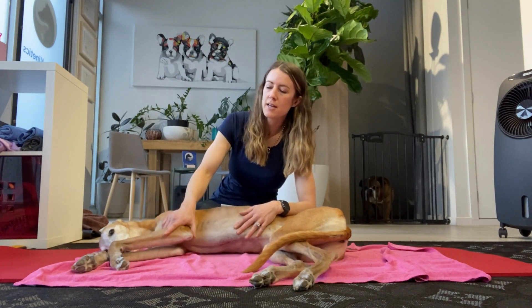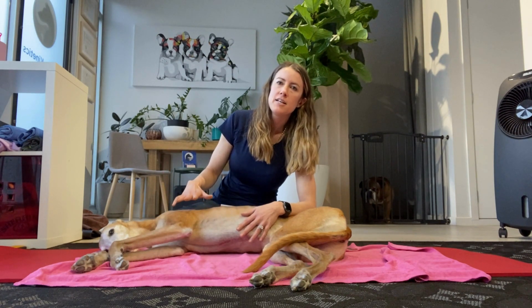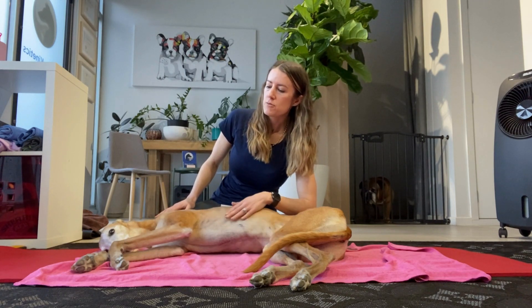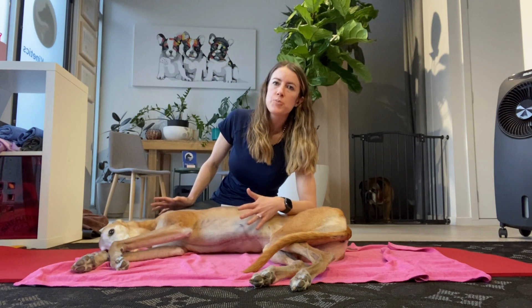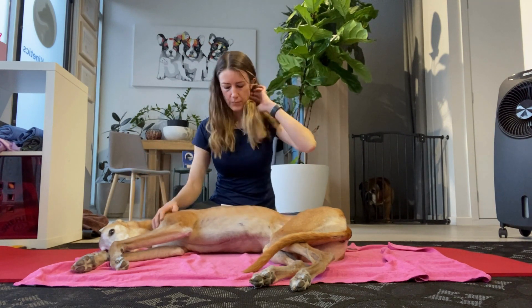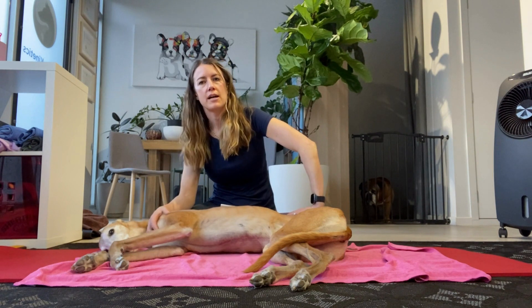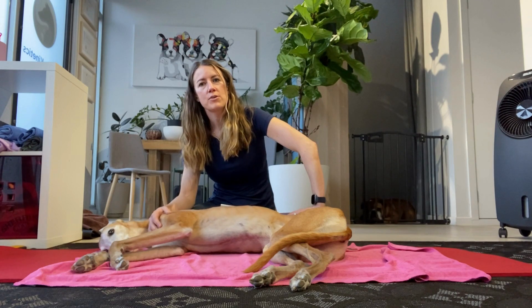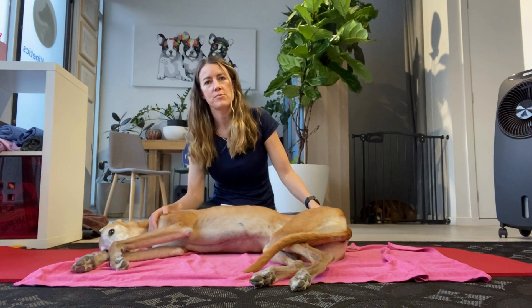I prefer to do it in lateral recumbency because it's really important that you actually stabilize the scapula — if you don't, your angles are going to be a little bit skewed. For normal ranges in a giant or large breed dog, you're looking at about 30 degrees of abduction. 35 to maybe 45 degrees is mild instability, 45 to 65 degrees is moderate, and above 65 degrees is pretty severe instability. Let's get into measurement.